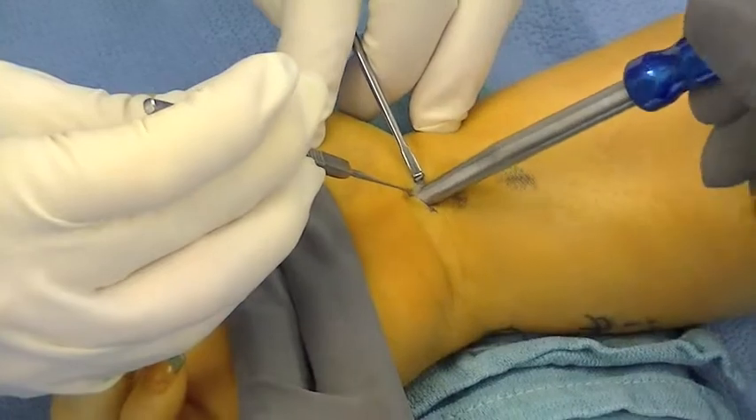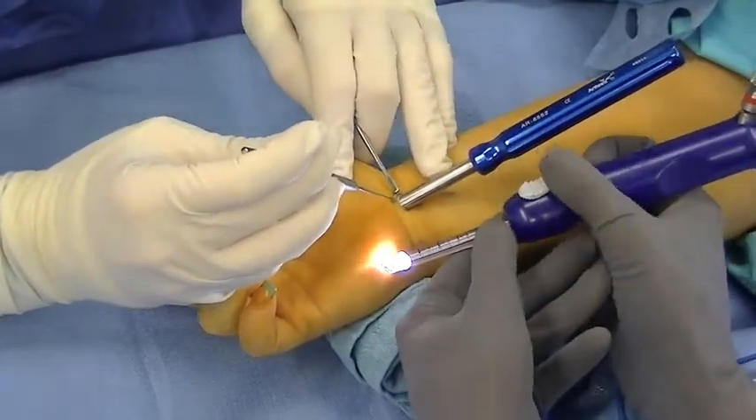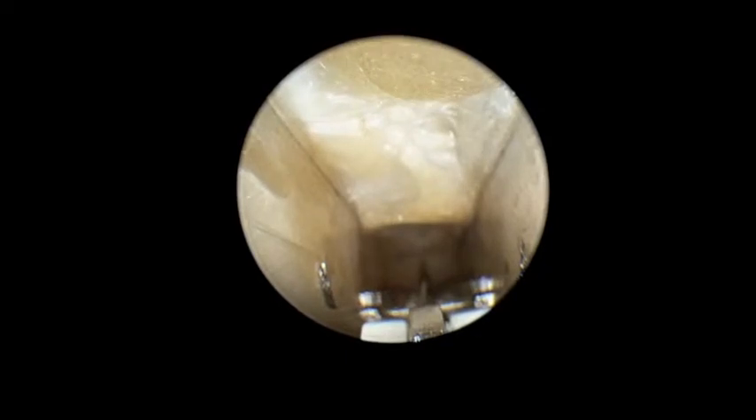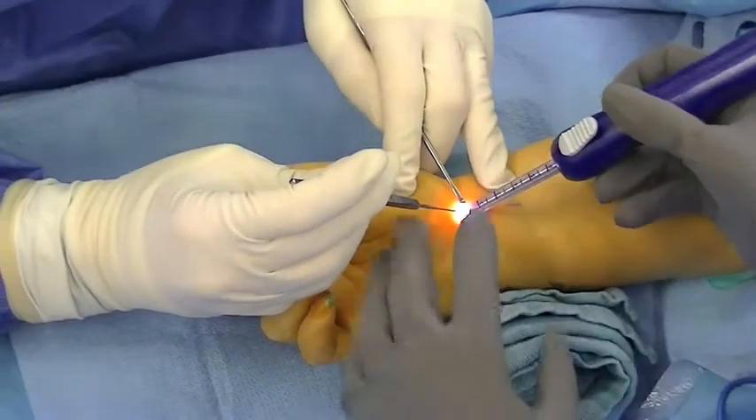The synovial elevators reflect the synovium from the transverse carpal ligament, and then carpal tunnel dilators prepare a path for the centerline Arthrex device. Here you can see the device inserted with the distal portion of the ligament identified.